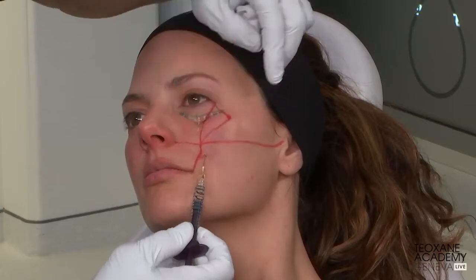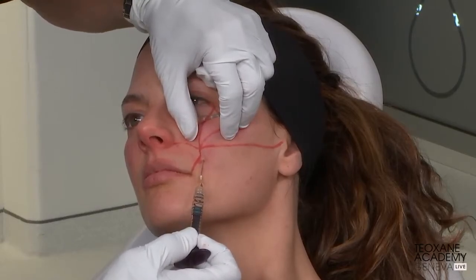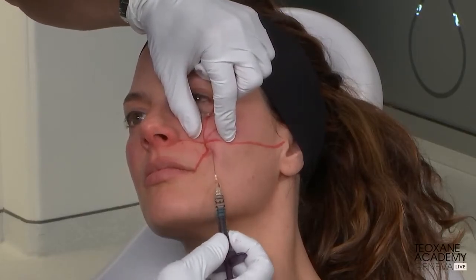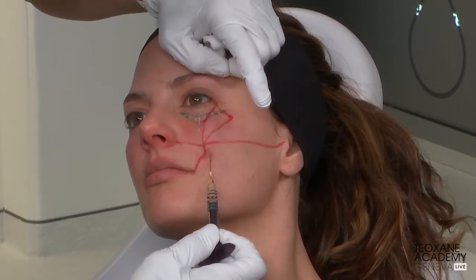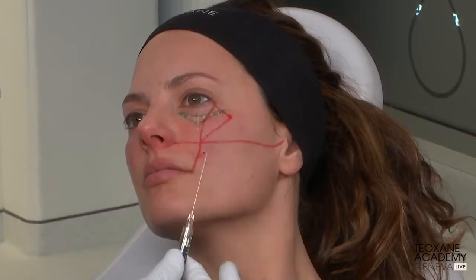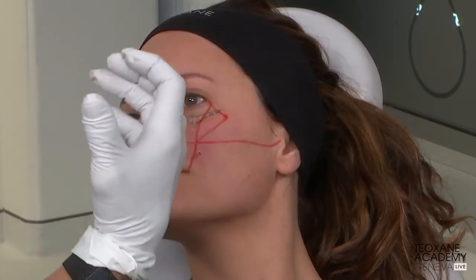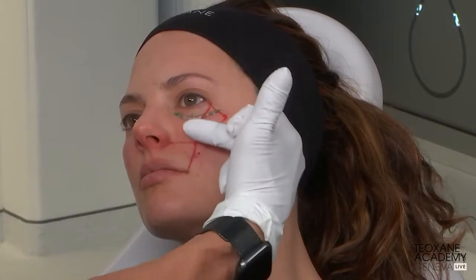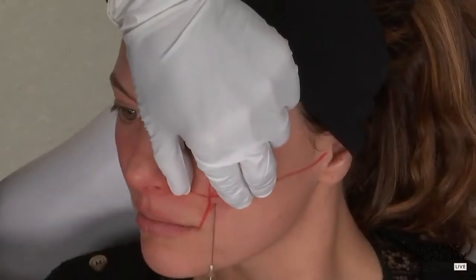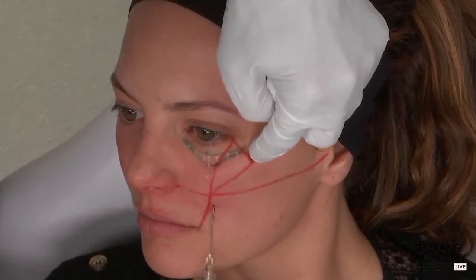Francesco, why don't you use your entrance point, your G point, to put your RHA4? Is there something you want to achieve by the crisscross, or is it just a question of entrance point? I think, Patrick, by entering down below in the first part, I give height to the cheek. I bring back the fat pads that descended and atrophied over time, and they are exposing more of that bone. So I like to put an edge to the descended fat pads there. Could you do the same with a bolus technique through the skin?